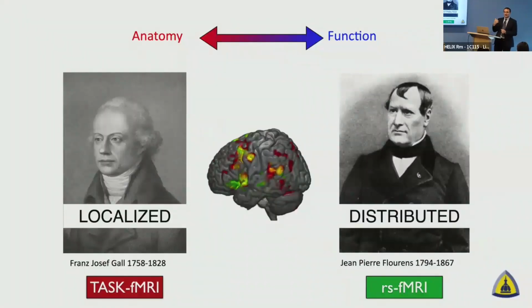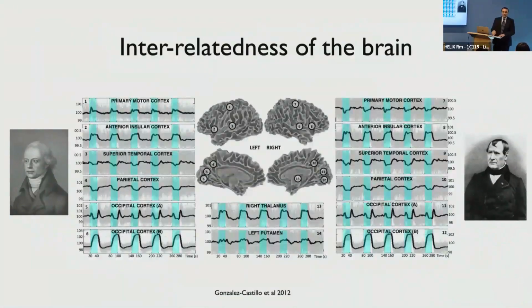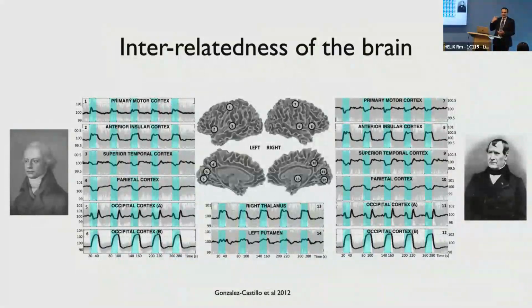Given what I just showed you, the task fMRI seems to localize brain function, right? And there were specific areas of the brain where language was noted to be active when they were thinking of words. It turns out we tend to want to view the brain as having local functional regions. Like if you think about the visual system, then it's in the visual cortex, right? I think a lot of people know the motor cortex, right? The precentral gyrus. Everybody knows that that's the area of the brain that subserves motor function. But what about the rest of the brain?